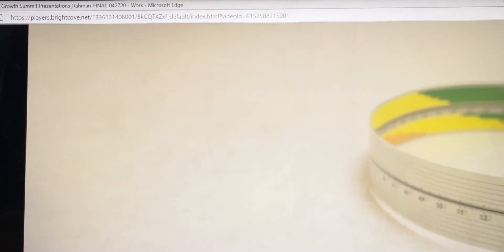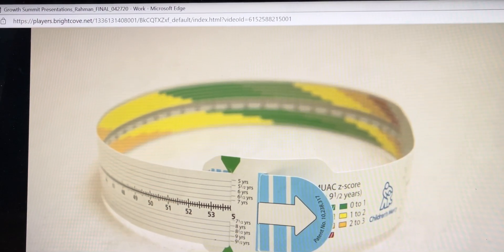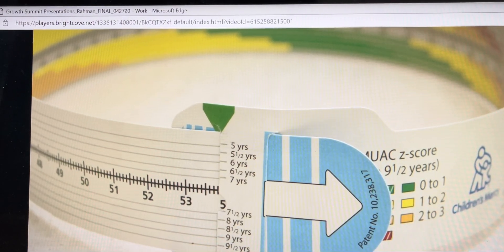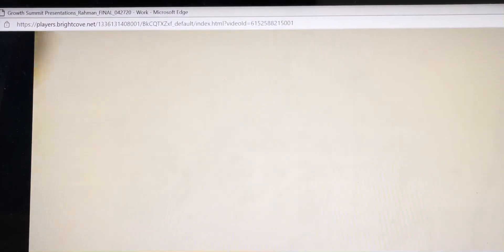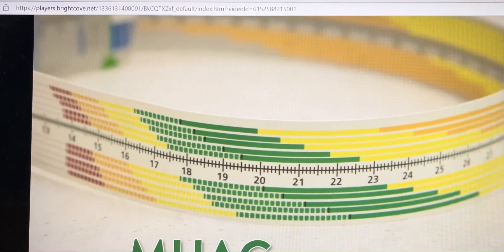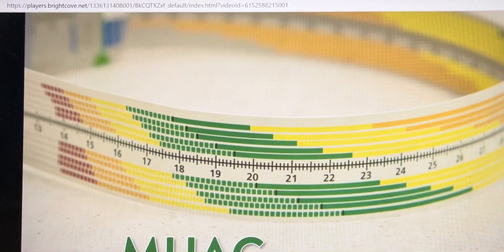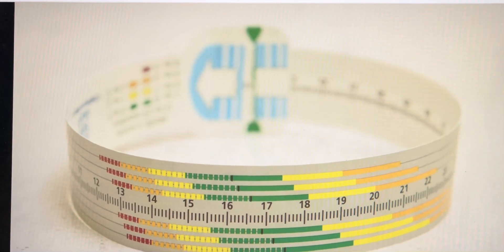Mid-Upper Arm Circumference is another important way to assess a child's growth. Measuring MUAC, just like height and weight measures, can indicate whether a child is in a normal anthropometric range for his or her age. Interpreting the MUAC by using Z-scores — standard deviation above or below the mean measurement for the child's age — can be just as sensitive as Body Mass Index, or BMI, for assessing growth in children.